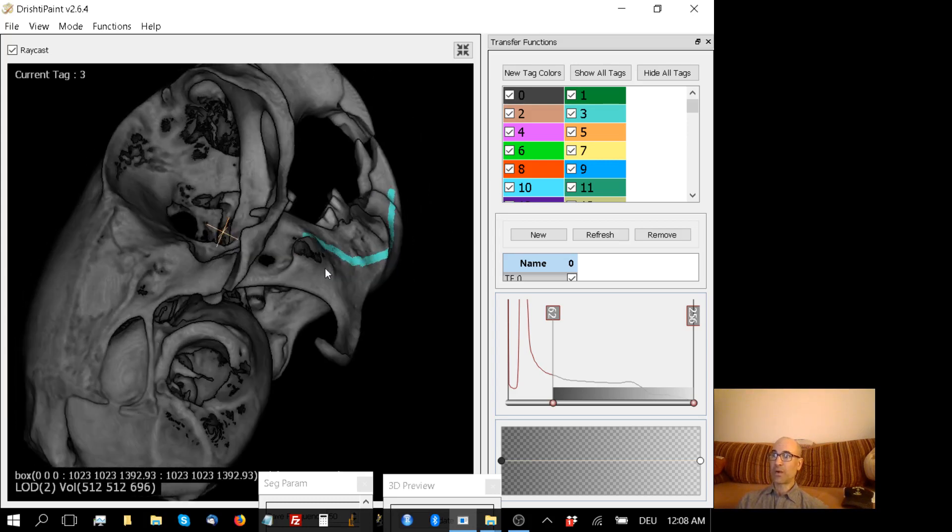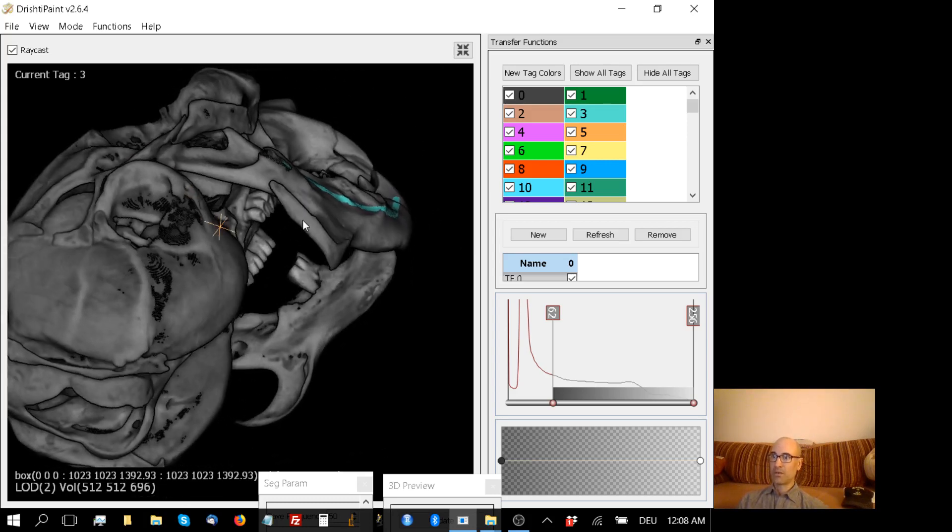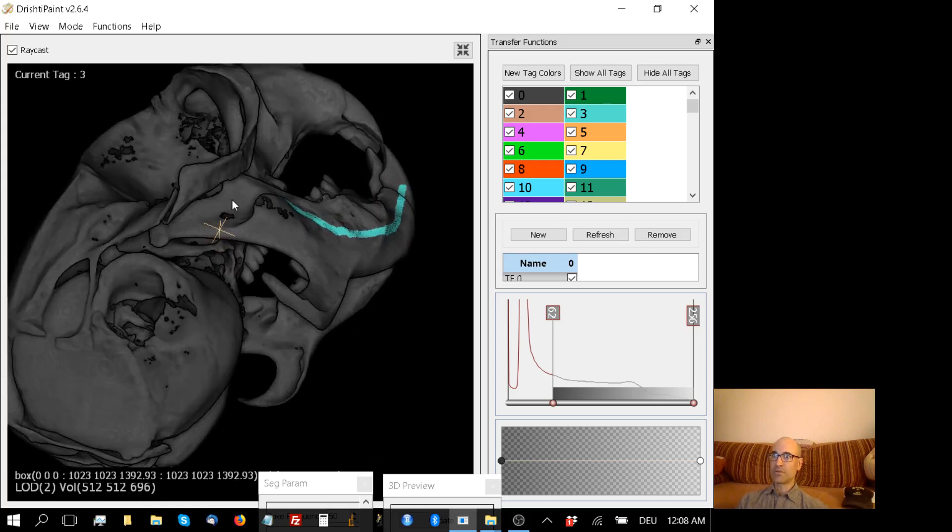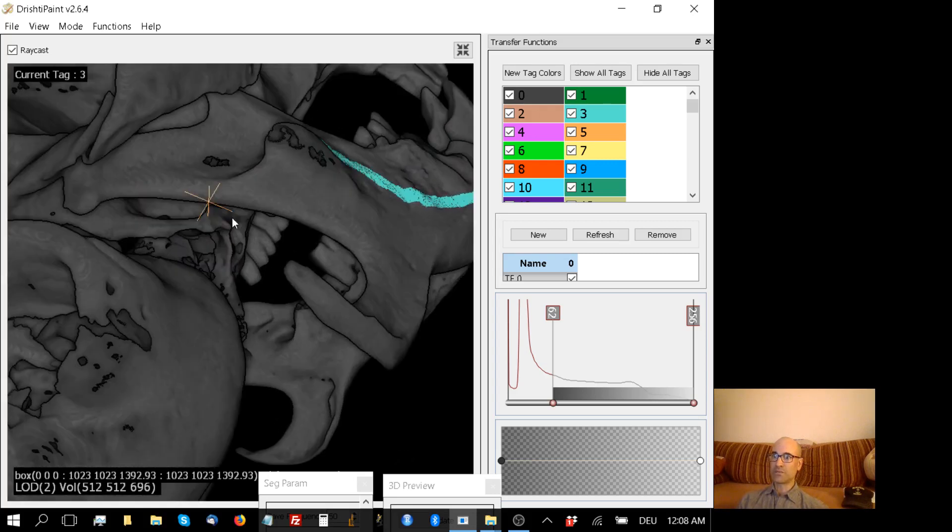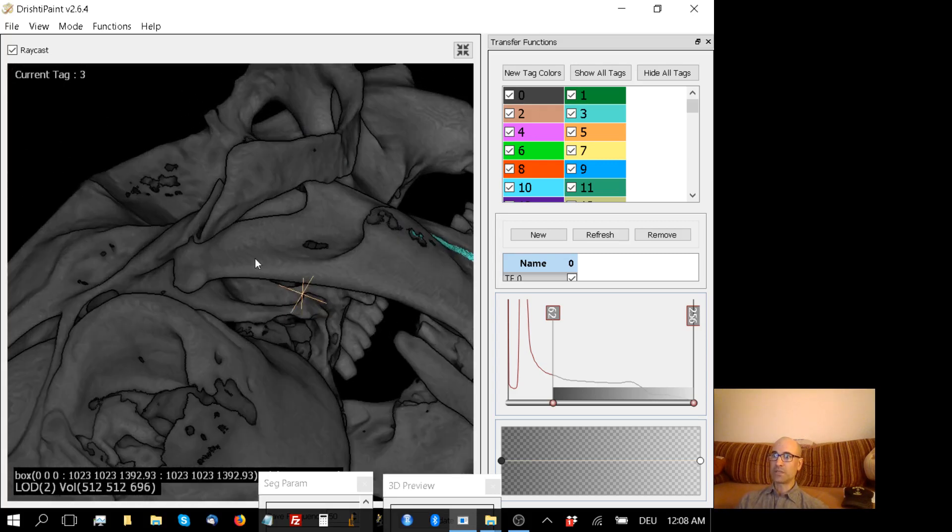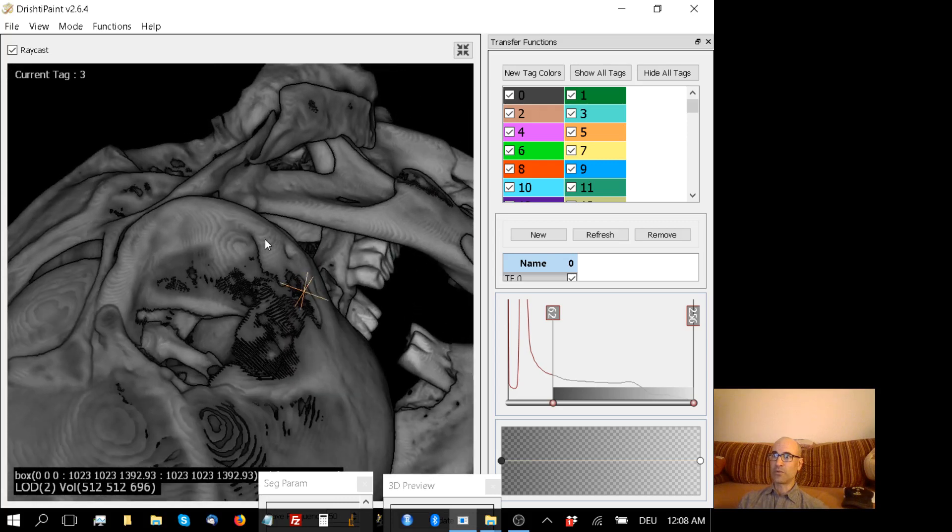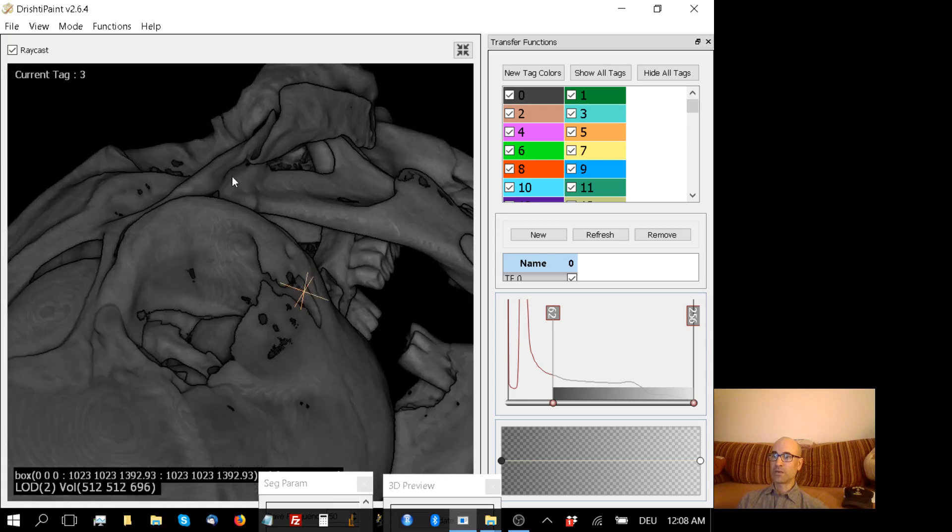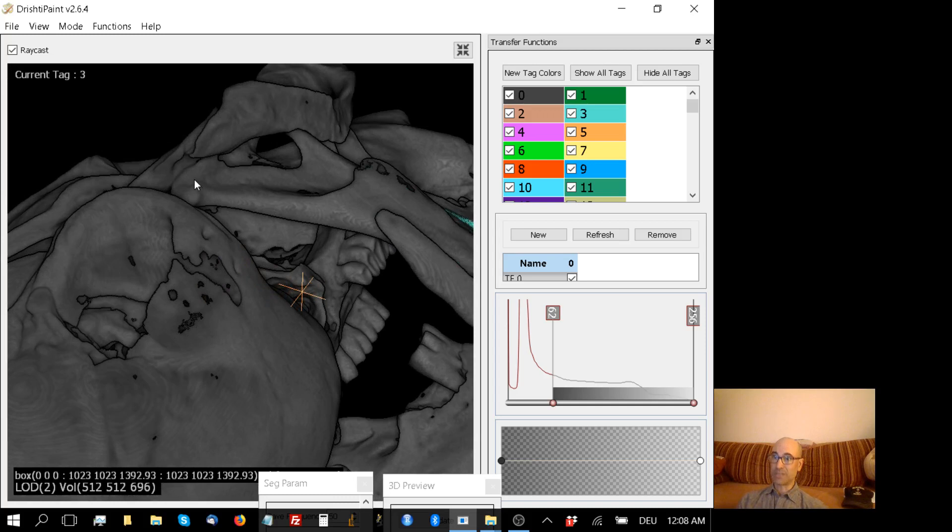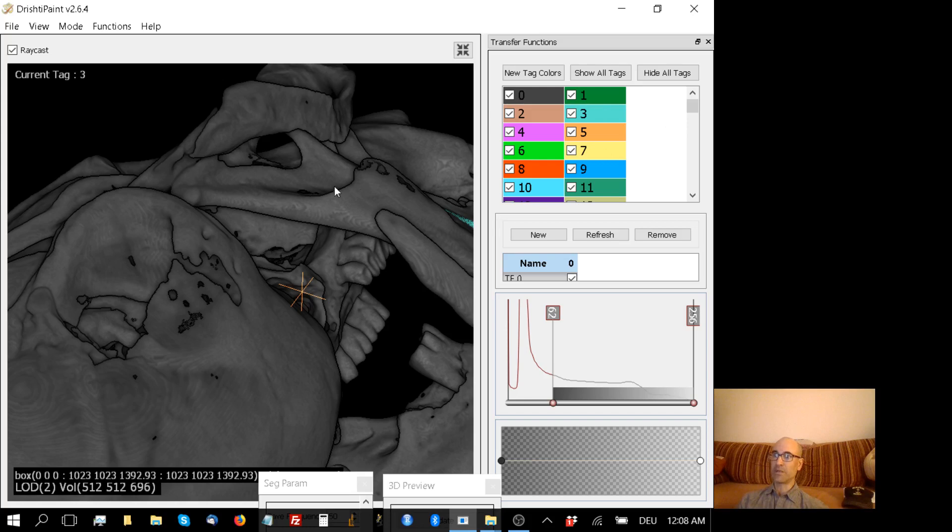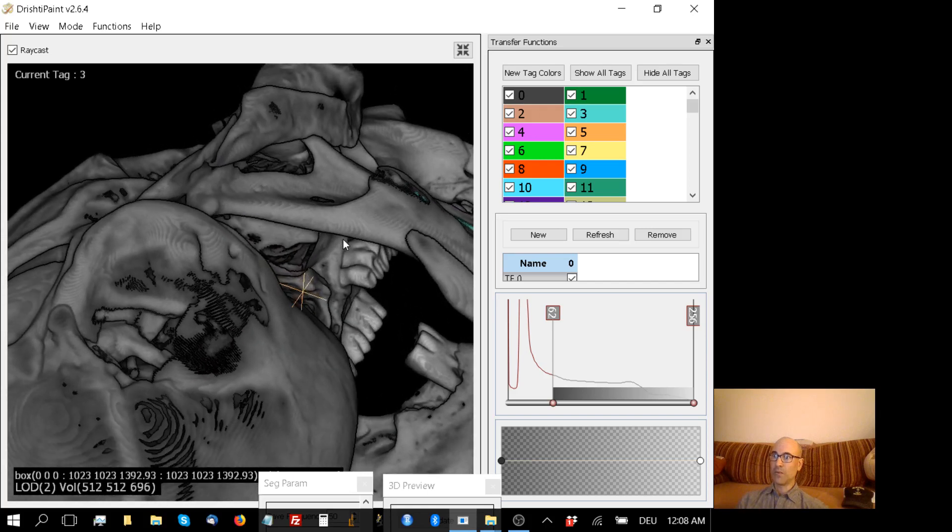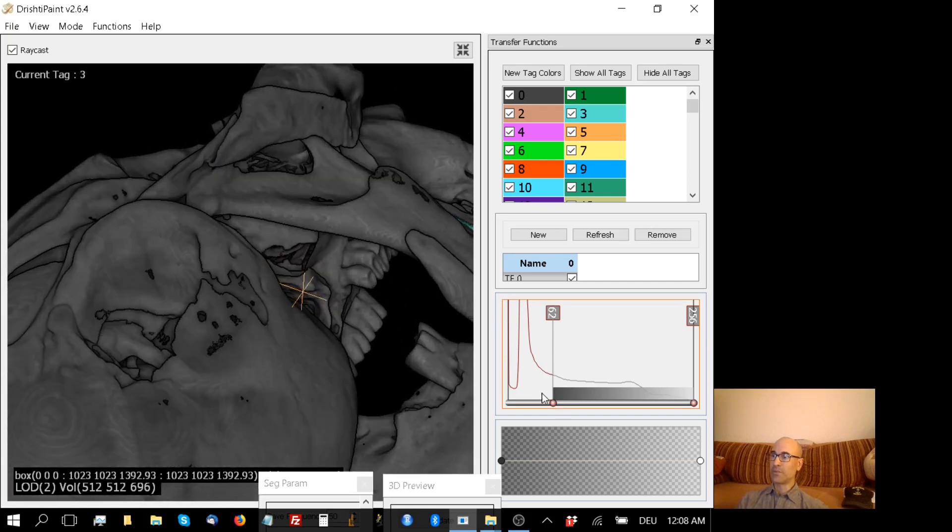The problem here, however, is that the jaw, because of the details of the CT scan - as you can see up here where the dentary articulates with the squamosal, that's the jaw joint - that is touching. So if I just hit F right now, it's going to turn the whole skull tag 3. And I just want the jaw to do that. So there are a couple of ways to go about this problem.